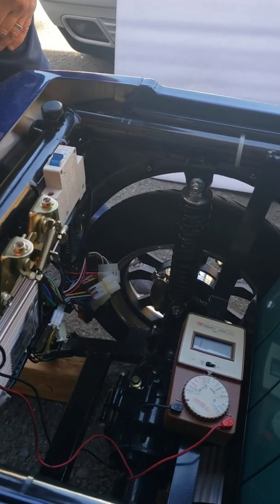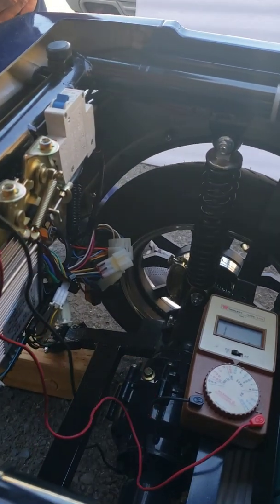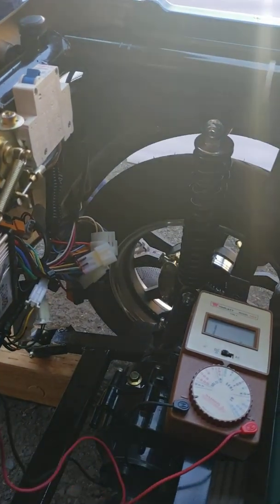I hope that was helpful for you — how to diagnose if you have a problem with the controller or the accelerator handle. Thank you, bye.